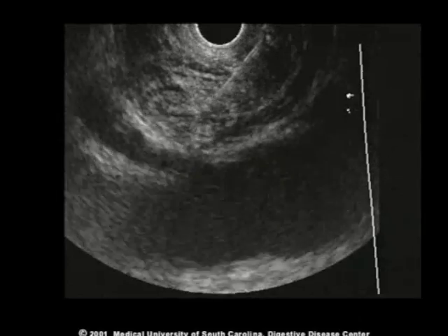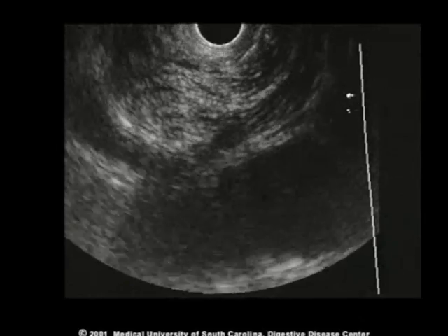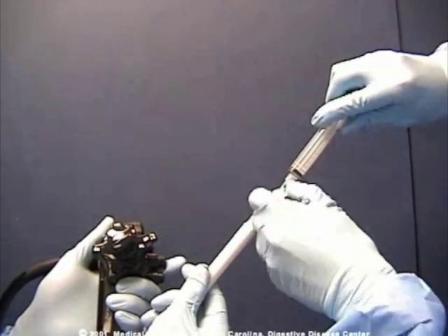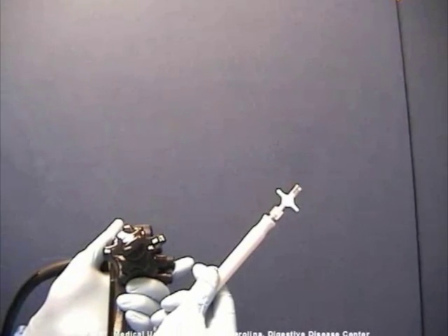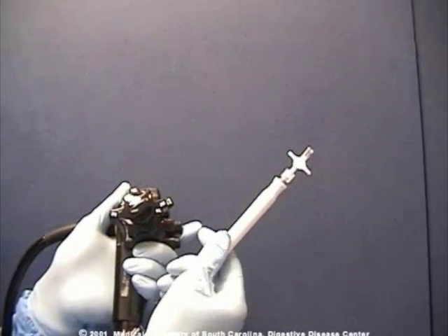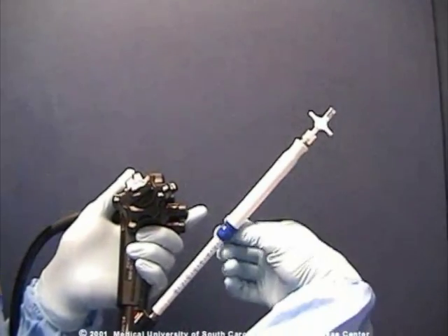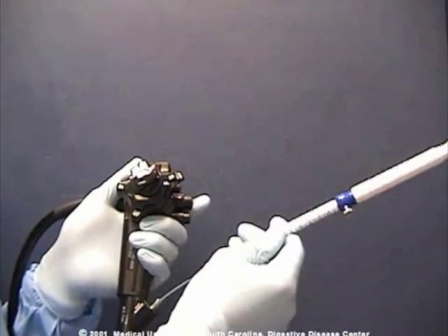Once the injection begins, it is very important not to move the needle back and forth. After completion of the injection, the syringe is removed, the needle is withdrawn, locked up, and the entire apparatus removed.